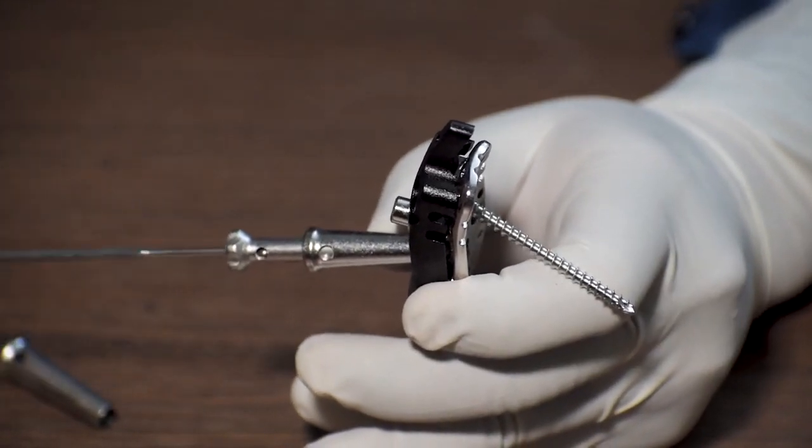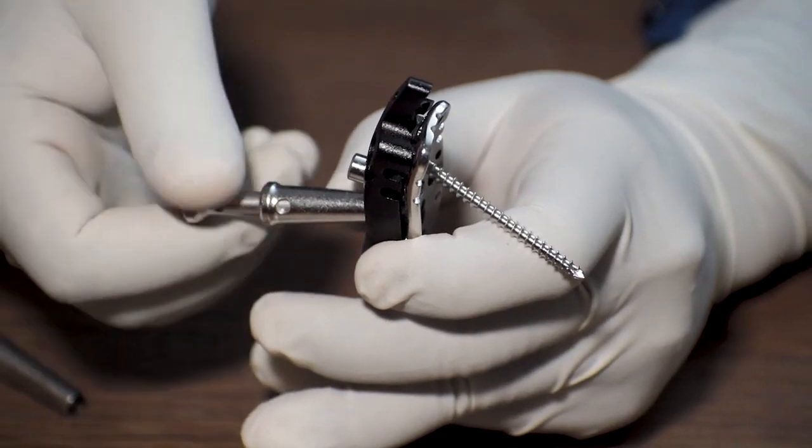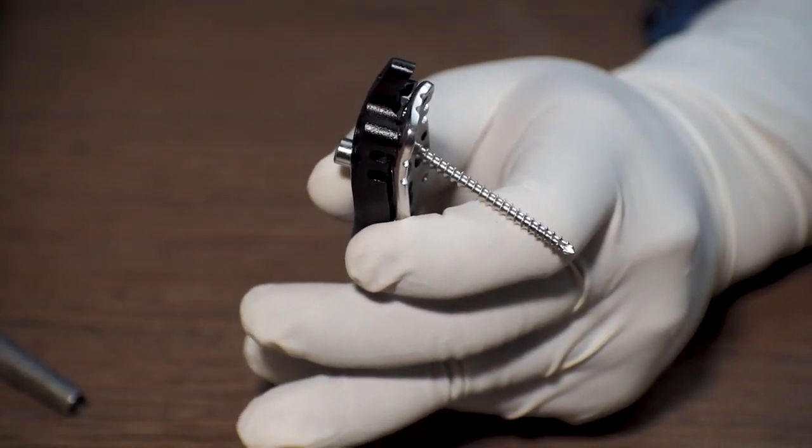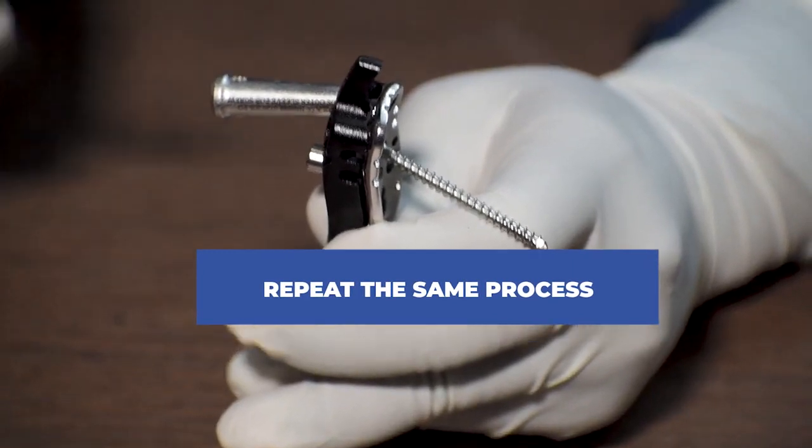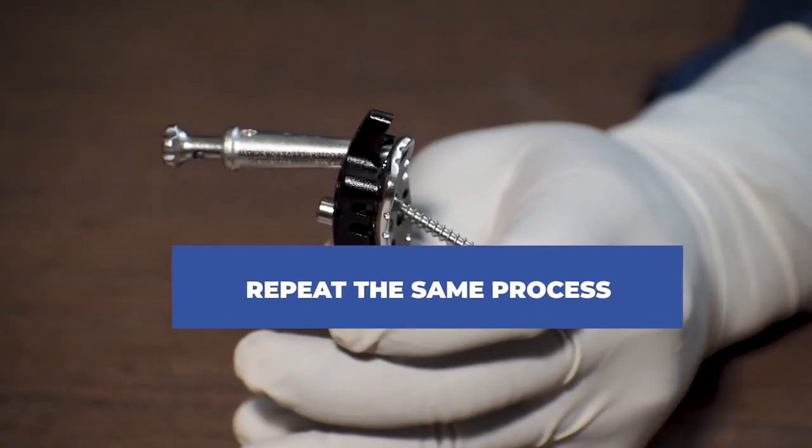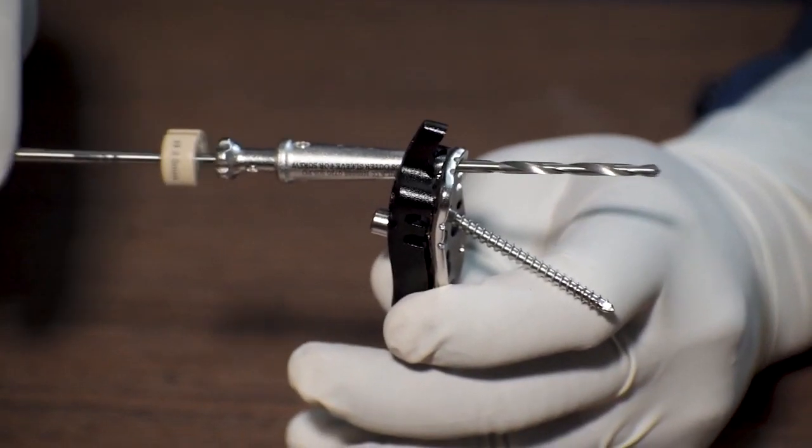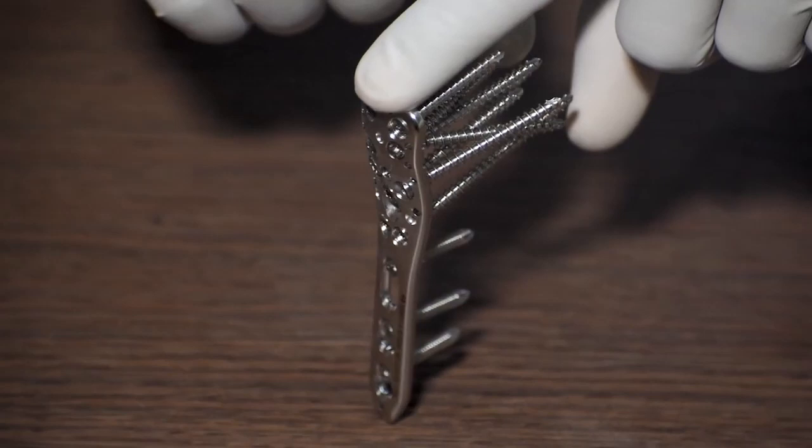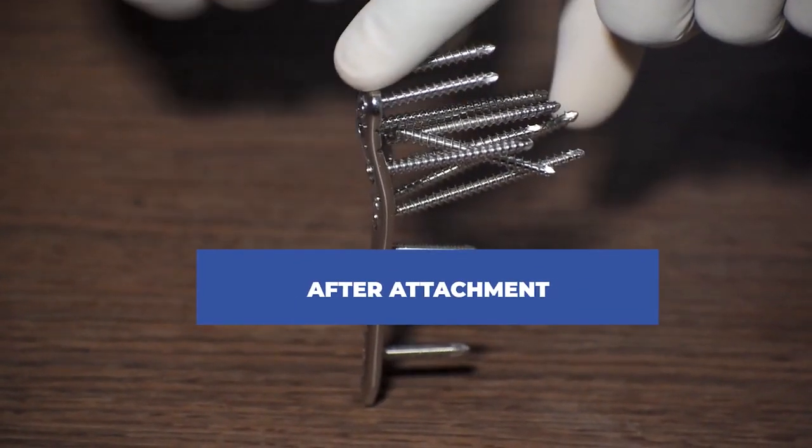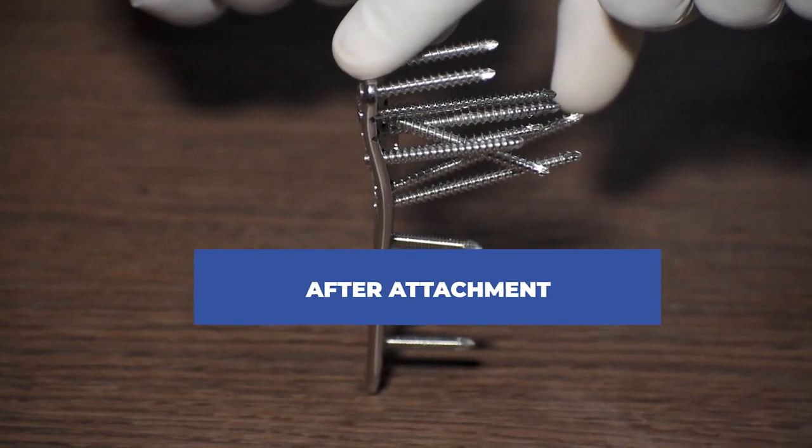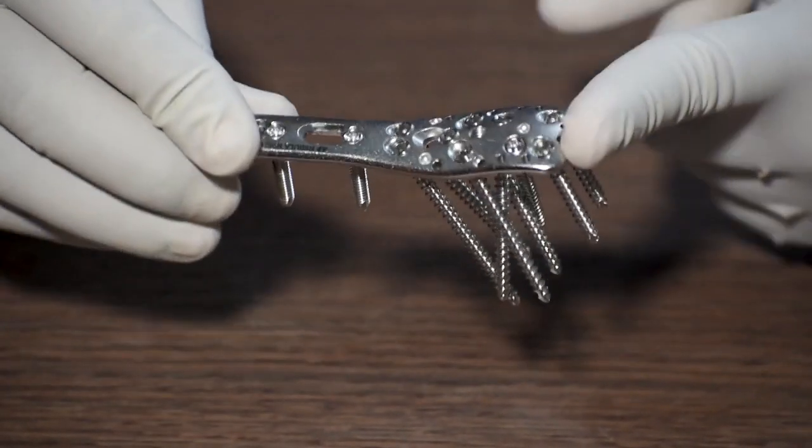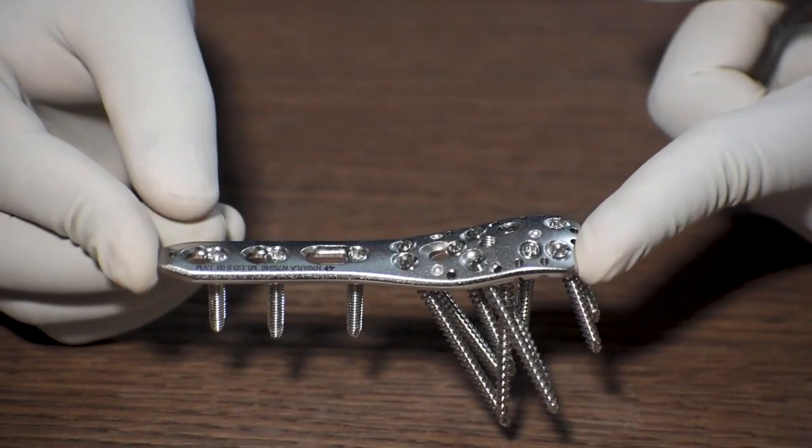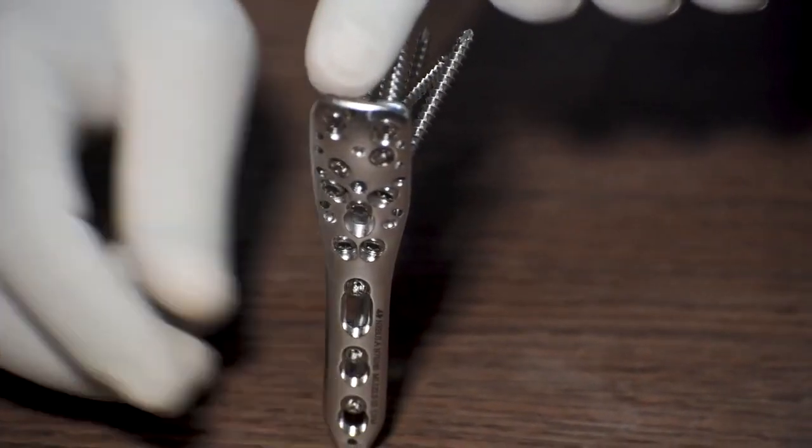Once the screw is attached, we will remove the reduction device. Then we will remove the drill sleeve and the outer sleeve. Thereafter we will repeat the same process to fix all the other screws as desired by the surgeon. As you can see there is a process that you can remove the screw.